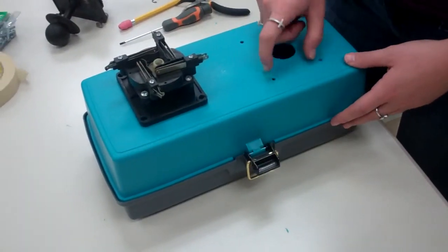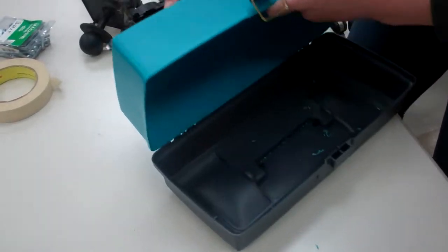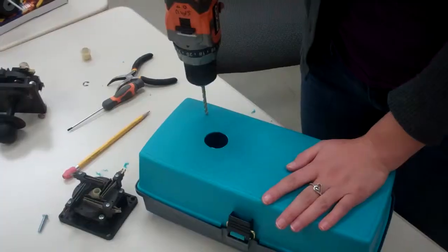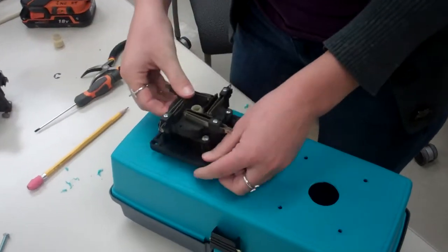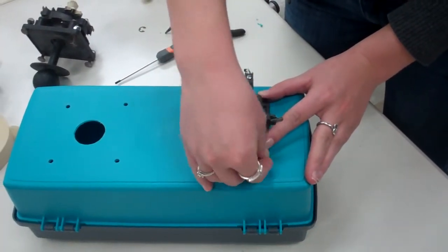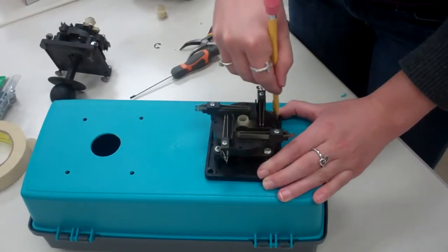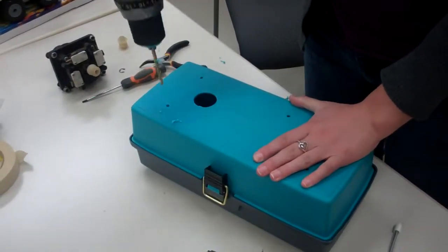Next, we're going to mark the holes for the screws of this piece. Put it on this part, open it up, make sure it's centered, and then mark one of the holes to get started. Now we're going to put this screw in to mark the other holes. Then drill the rest of the holes — just poke the wire through and clip off the excess.